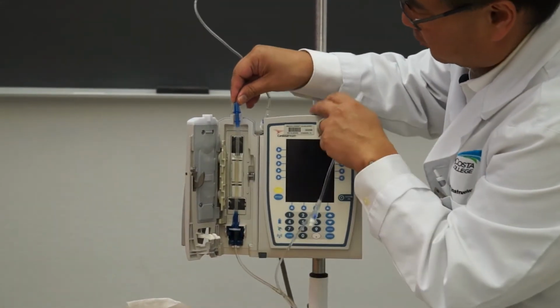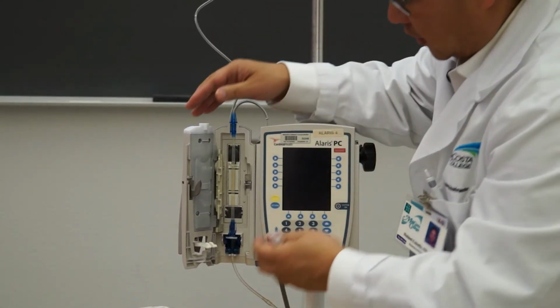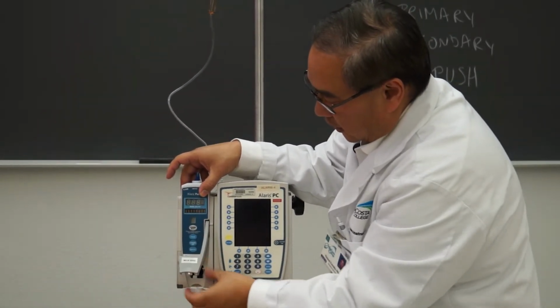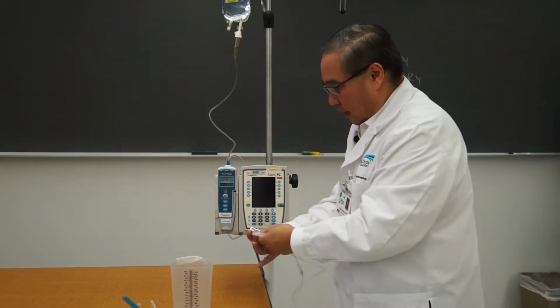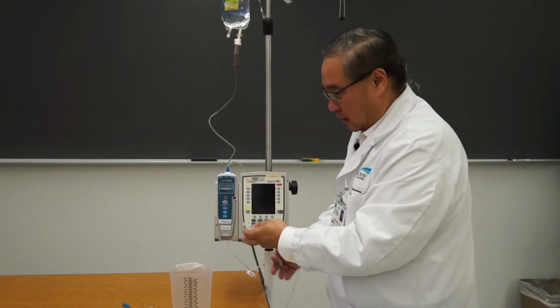Here you have the flexible tubing. I'm going to raise it up and drop it in the top. Then I can close the door by lifting it up here, making it flat here, and then I'm just going to press the bottom in, and that locks into place. At this time, I can now open the roller clamp because this is what's controlling the amount of fluid.